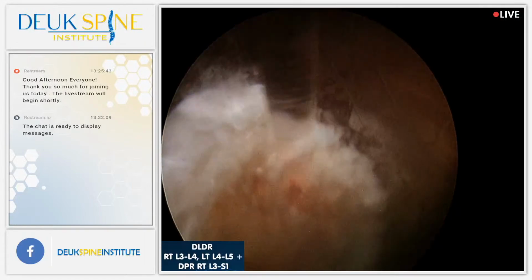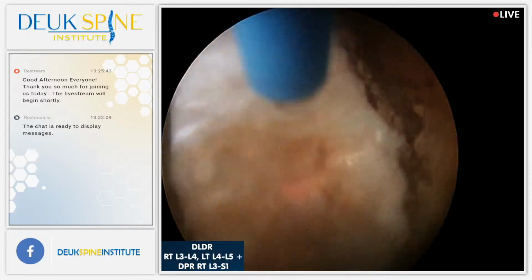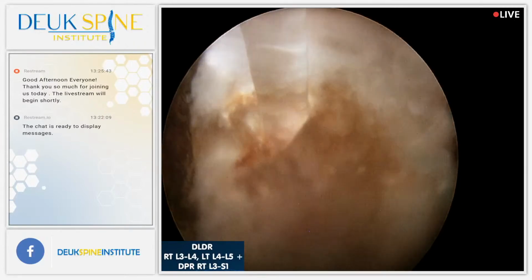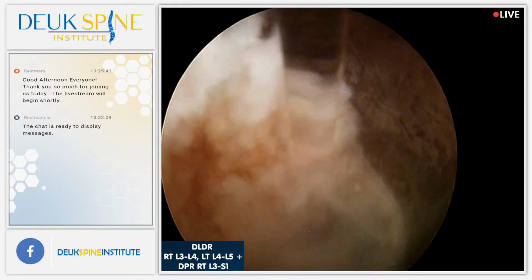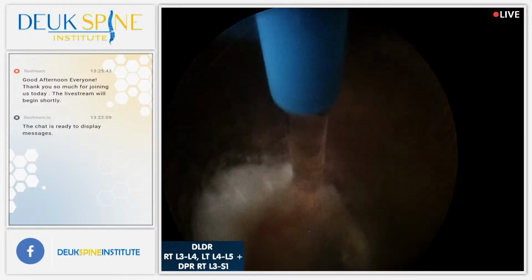This is all scar tissue, by the way, from chronic inflammation. Years and years of inflammation, pain in his disc. Massive amounts of scar tissue. All the white stuff, scar tissue. You guys see all that? Then the blue stuff is the herniation. Fresh herniation. Newer. All right, any questions from our audience?